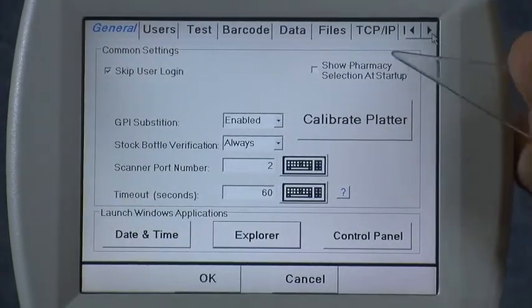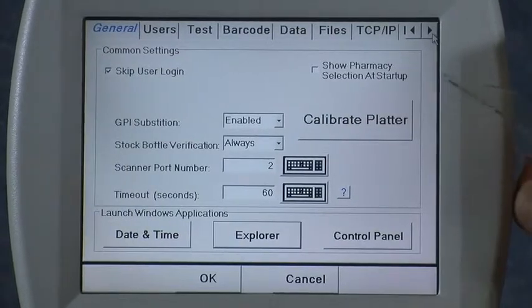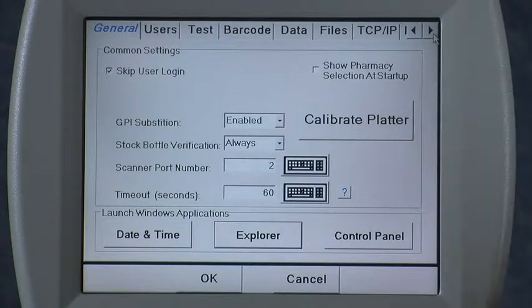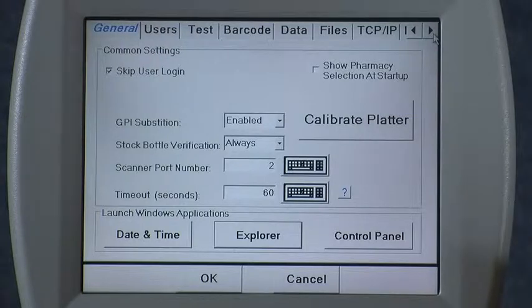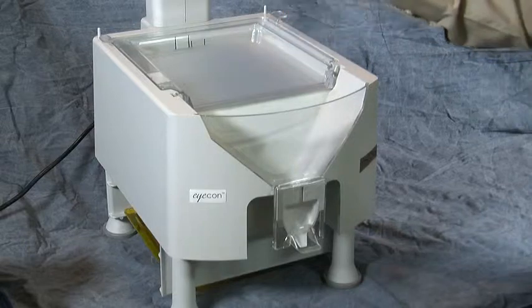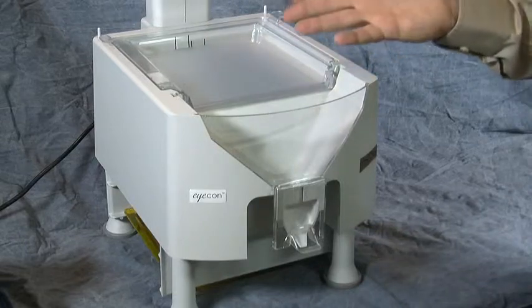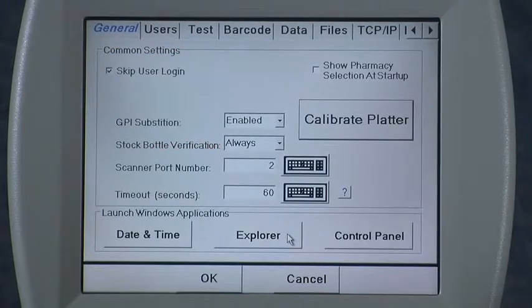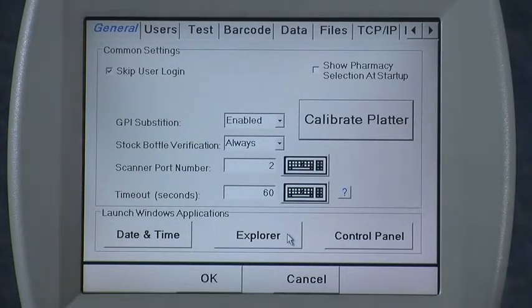One of the most common problems people experience on their icon is the Calibrate Platter. If you're in the count mode and before you've even poured pills on the tray you're getting a counting error, you probably just need to calibrate the platter. Make sure the tray is clear of any pills and no excessive pill dust buildup, then press the Calibrate Platter button. A sound will beep and you should see 'Platter Calibration Successful.' Press OK, go back to the count mode, and your counting problems should be resolved. That completes the General tab of the icon.